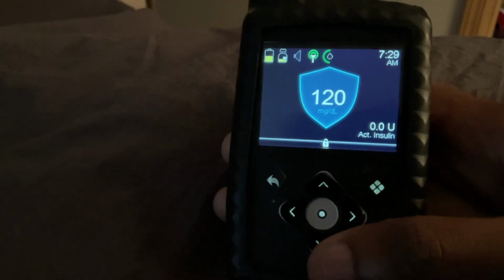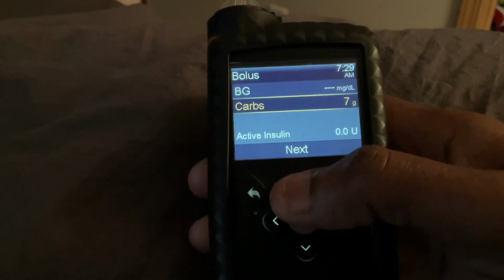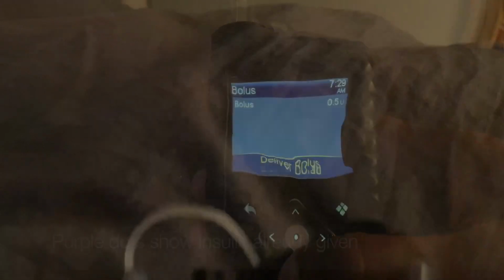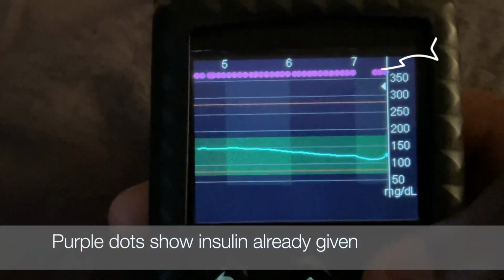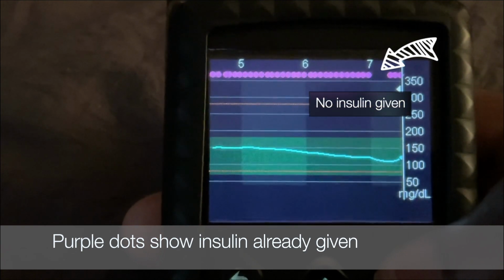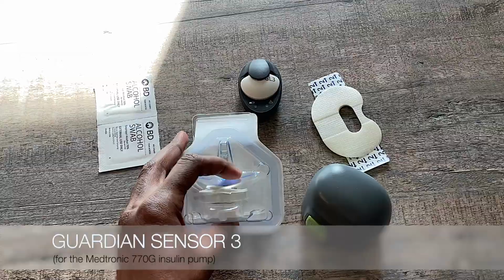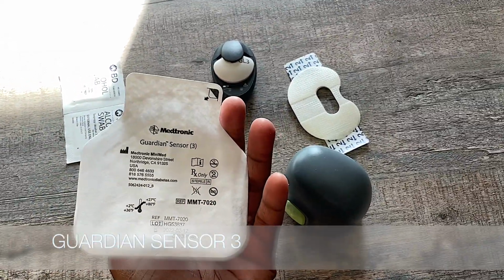This is important because the sensor talks to my pump, and the pump, based on the readings that it is getting from the sensor, tells the pump how much insulin to deliver to my body. If I am having a low blood sugar episode, the pump will slow down the amount of insulin it's giving me. So things I'm going to need are, this is the sensor.